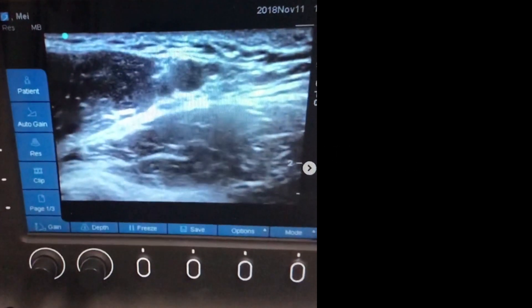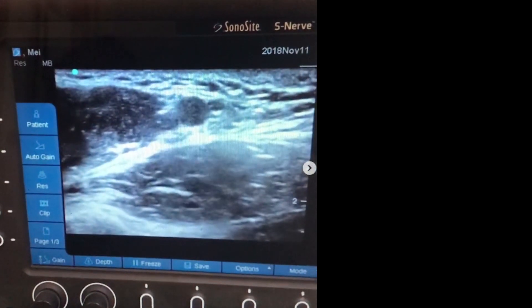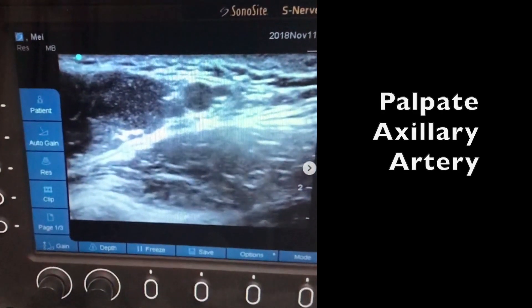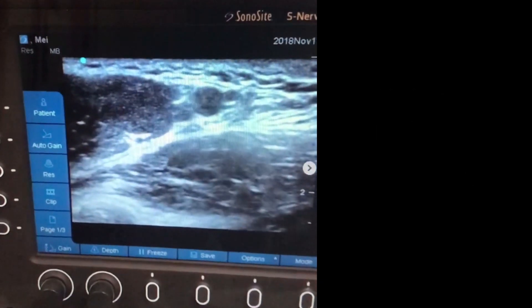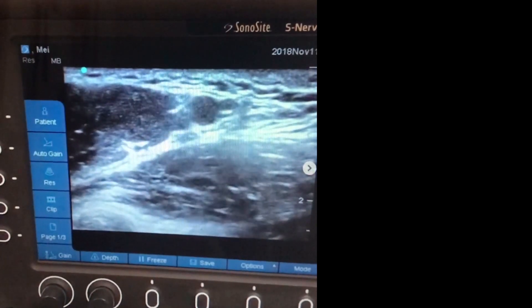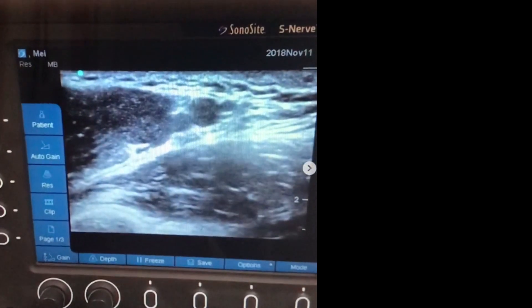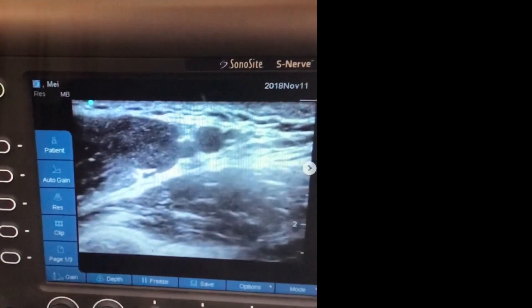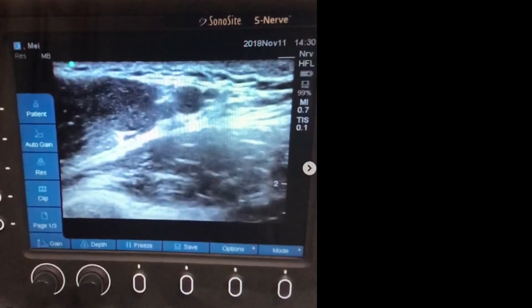This is the view for an axillary block — Pearl is finding it on me. With the probe, first palpate the axillary artery, then place the center line of the probe right on the axillary artery. Remember how we learned to check left versus right on the probe by poking your finger — the left side of the probe should be superior.